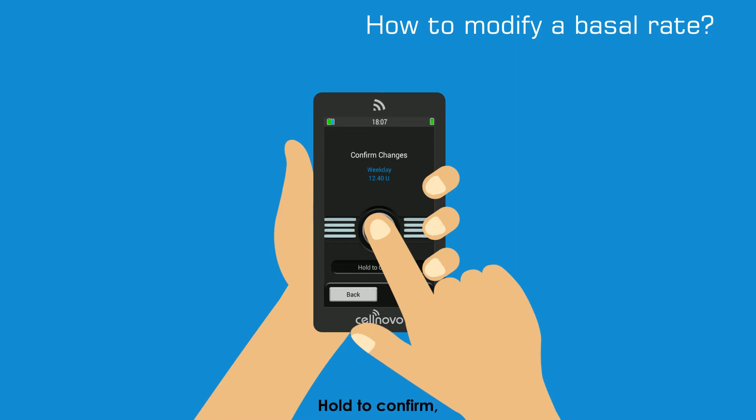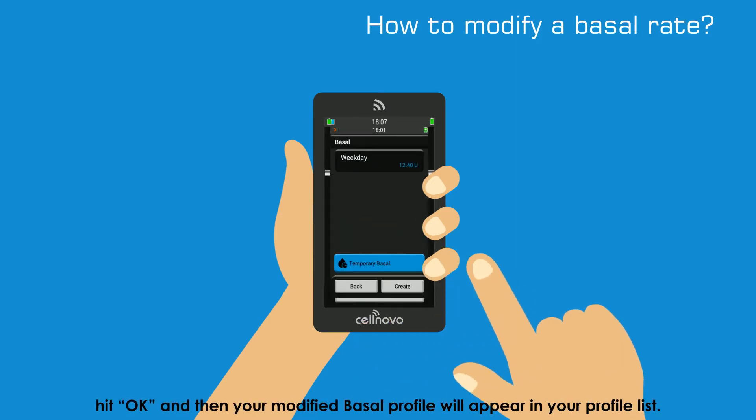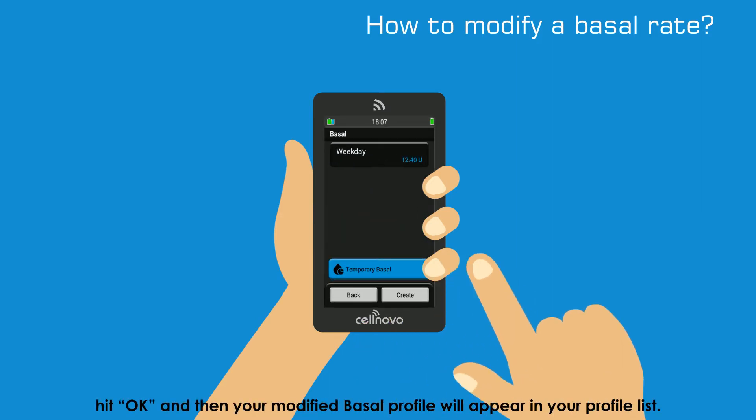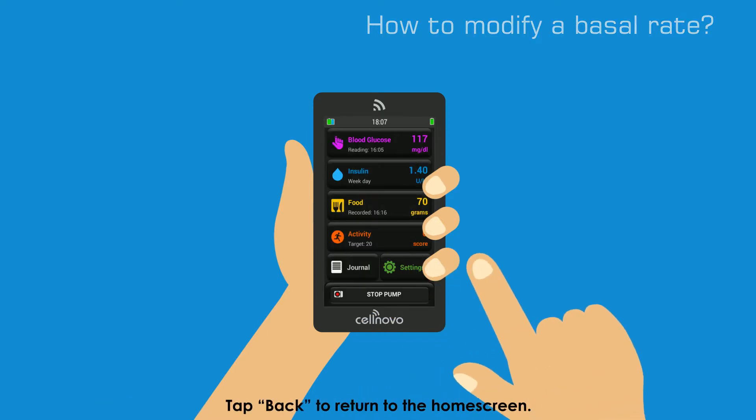Hold to confirm, hit OK and then your modified Basal profile will appear in your profile list. Tap Back to return to the home screen.